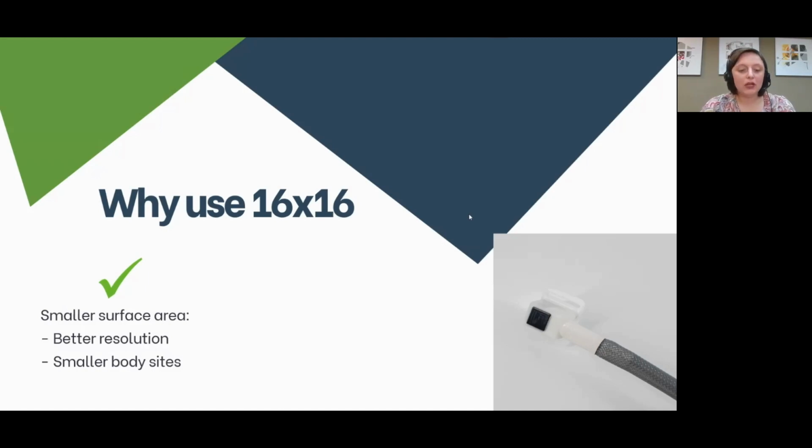And the pediatric population. Again, what are the limitations? First of all, there is no normative data available for this stimulation size, and it is a limitation, but it can be overcome, because if you are a researcher, you can have your healthy control group and compare your population to these healthy controls, matching your patient group.